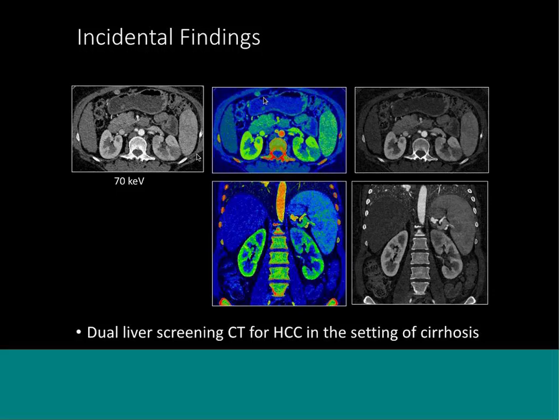If we look here, the kidneys still look a little asymmetric, but if you look at the color images and the iodine-only images, you can really see that while this kidney has a lot of iodine, a lot of iodine in the cortex here, man, it's not that same appearance on this side, right? You guys can appreciate that these renal cortices don't look the same. Same thing on the iodine images. This is easier to see. You have to take my word for it in here. We have hindsight bias now because you've already seen it here, so you can't appreciate that this is easier. But it does accentuate the differences.